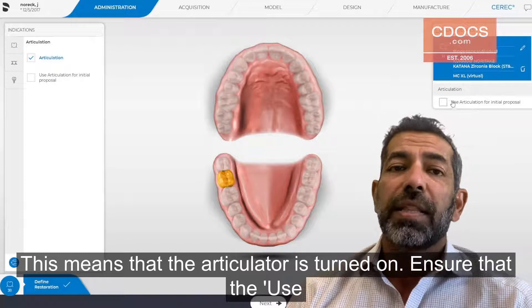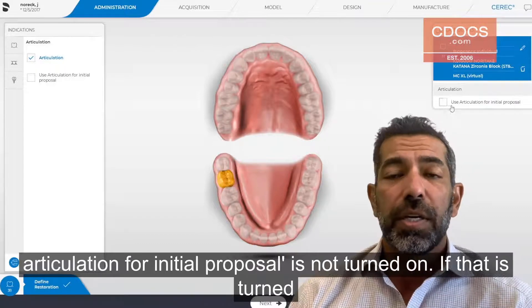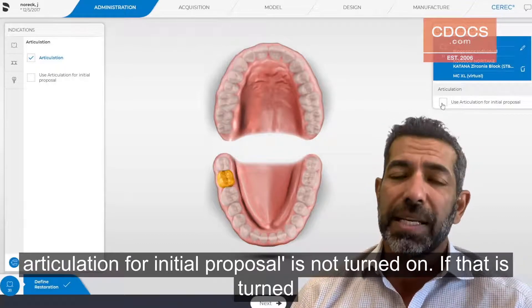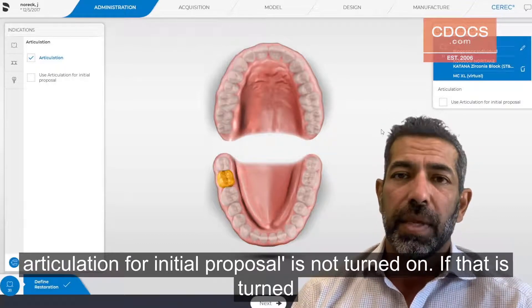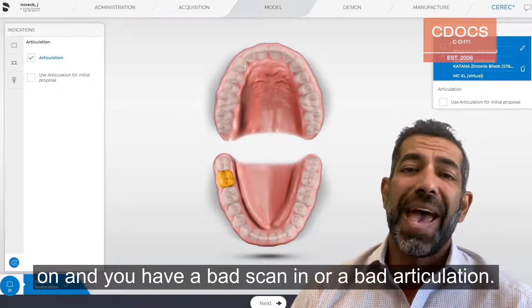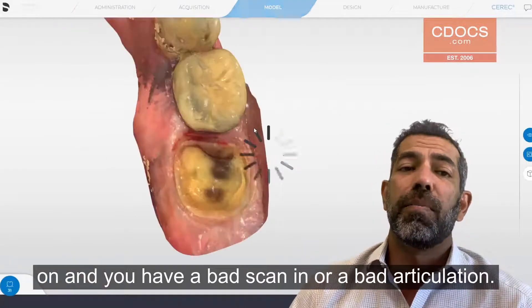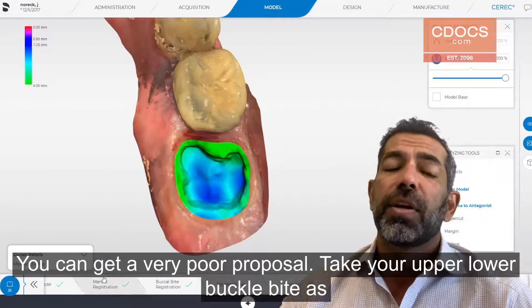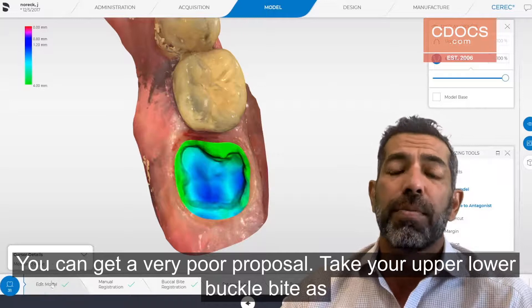Ensure that the 'use articulation for initial proposal' is not turned on. If that is turned on and you have a bad scan and/or bad articulation, you're going to get a very poor proposal.